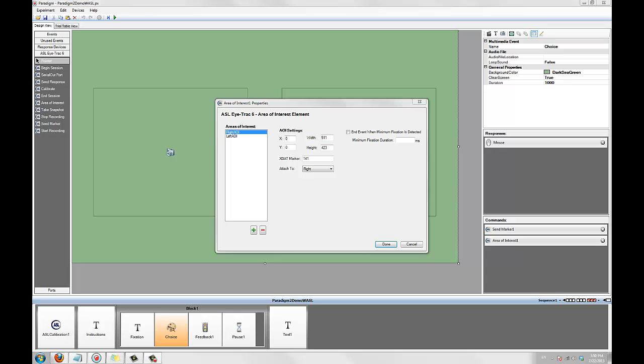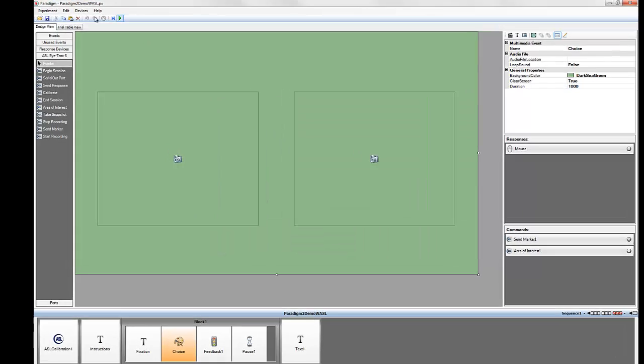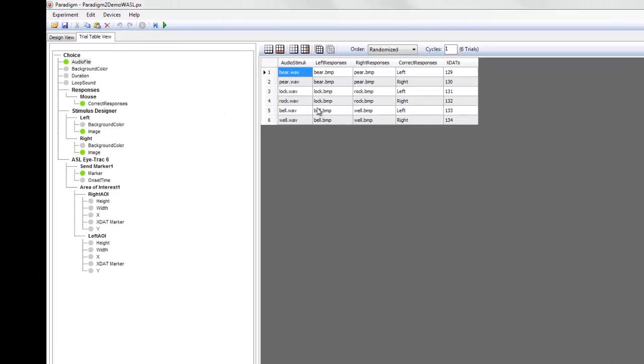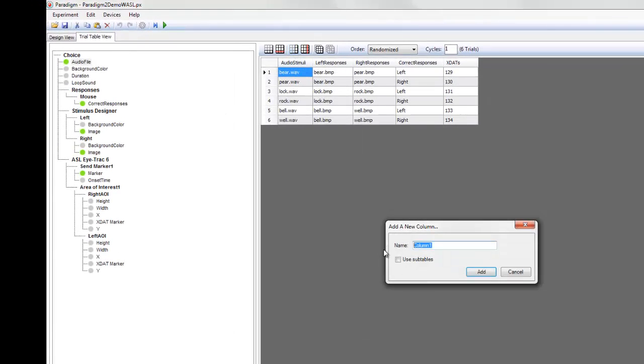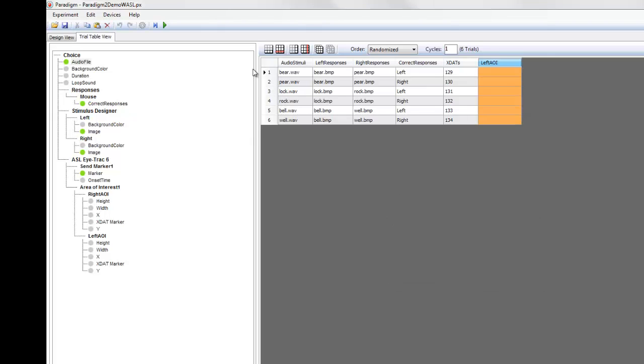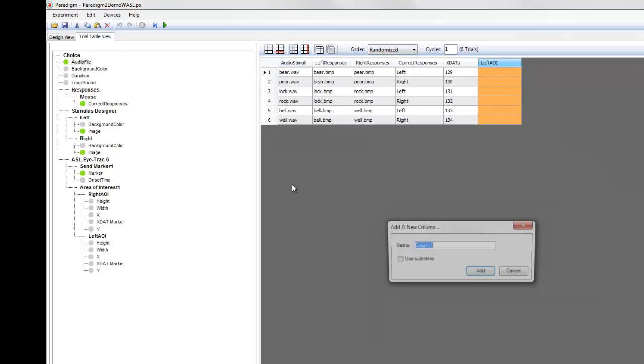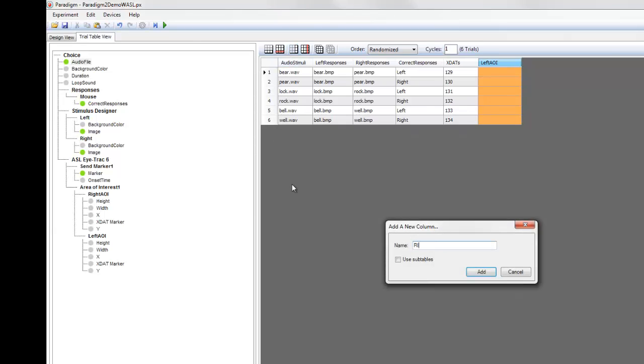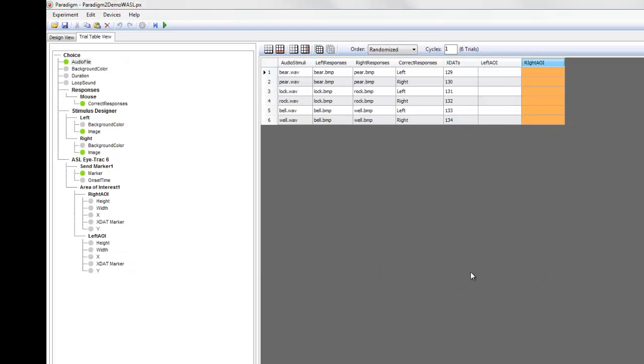Now we've specified static XDATs for each AOI, but we can also change them for each stimulus, which is fairly typical. To do that, we'll add two columns to the trial table. One for the left image AOI, and one for the right image AOI. We'll then add unique XDAT markers for each AOI.